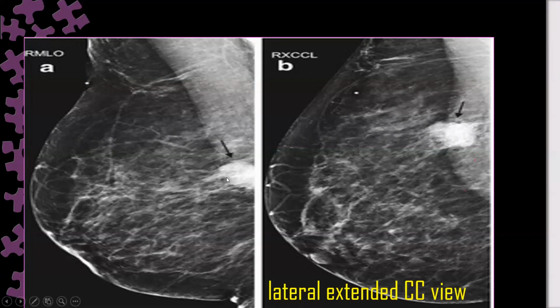But if you have done the lateral, we explained last time why they select mediolateral oblique instead of mediolateral. Why do they select the obliquity? Because the breast tissue rests along, and sometimes on or over, the pectoralis muscle. You can sometimes see breast tissue through the pectoralis muscle. That means you have deep posterior breast tissue.